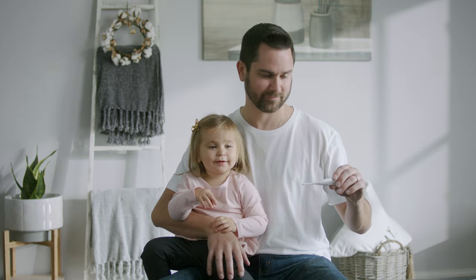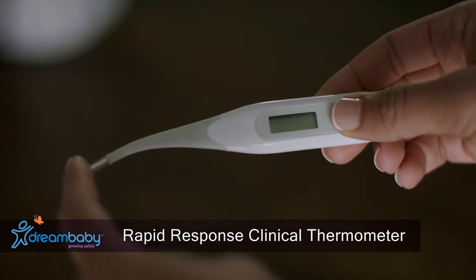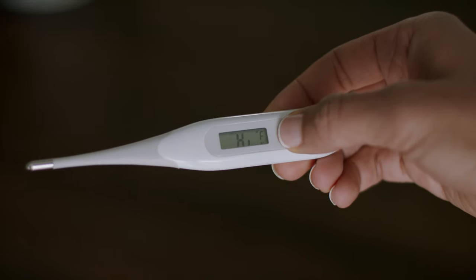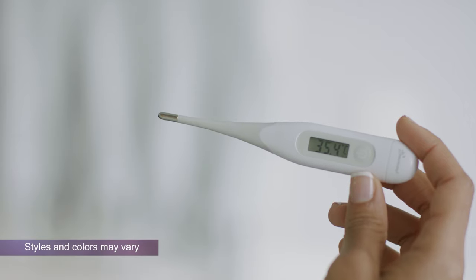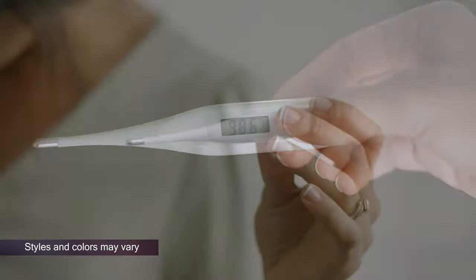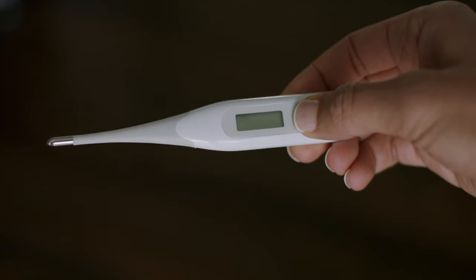Dream Baby's Rapid Response Clinical Thermometer has a flexible tip for comfort and gives an accurate oral reading in just 10 seconds. With an easy-to-read digital display, a memory function for the last temperature taken, Celsius and Fahrenheit options, and long battery life, the thermometer covers nearly every convenience.